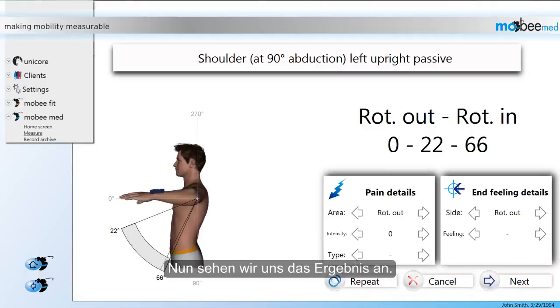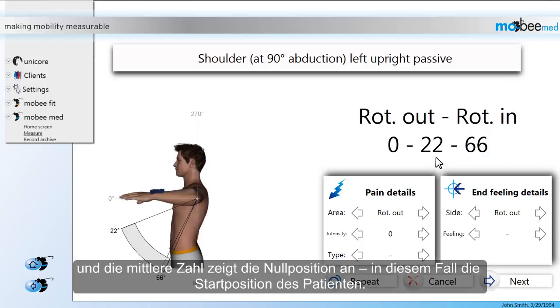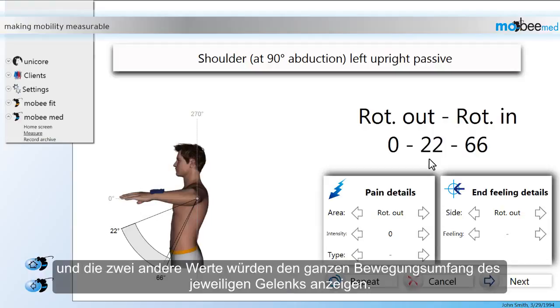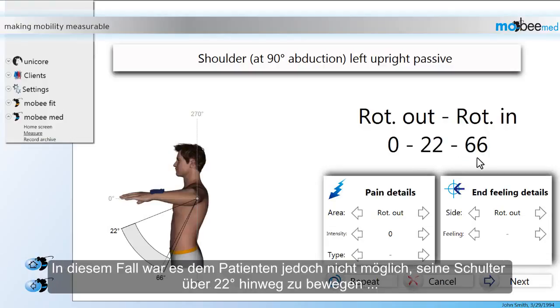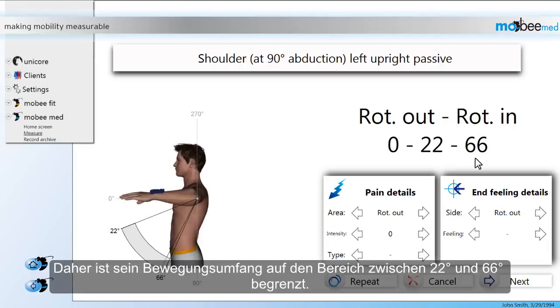Now let's take a look at the results. As you can see, the software shows three different values. The number on the left stands for the outward rotation. The number on the right indicates the inward rotation. And the number in the middle stands for the zero position — in this case, the starting position of the patient. Under normal circumstances the number in the middle would always be zero, and the two other values would indicate the full range of motion of the individual joint. However, in this case the patient wasn't able to move his shoulder beyond the 22 degree mark, and when it came to the inward rotation he was only able to rotate his shoulder to 66 degrees. Therefore his range of motion is restricted to the area between 22 and 66 degrees.